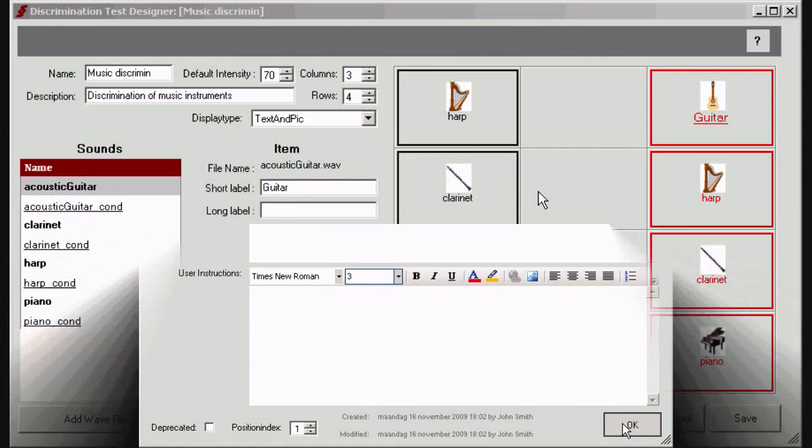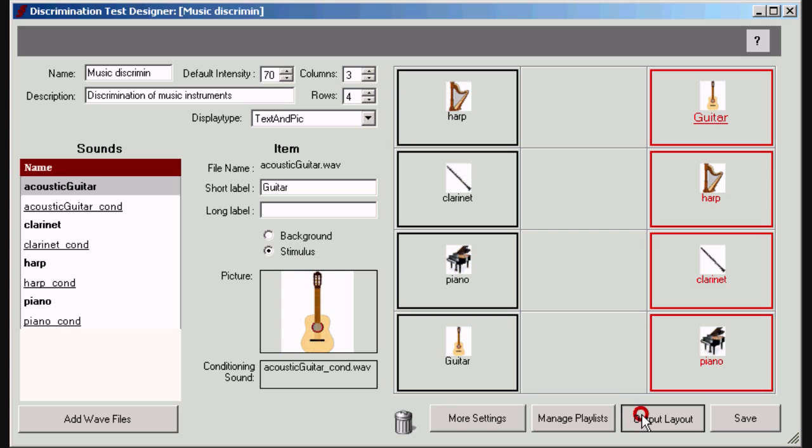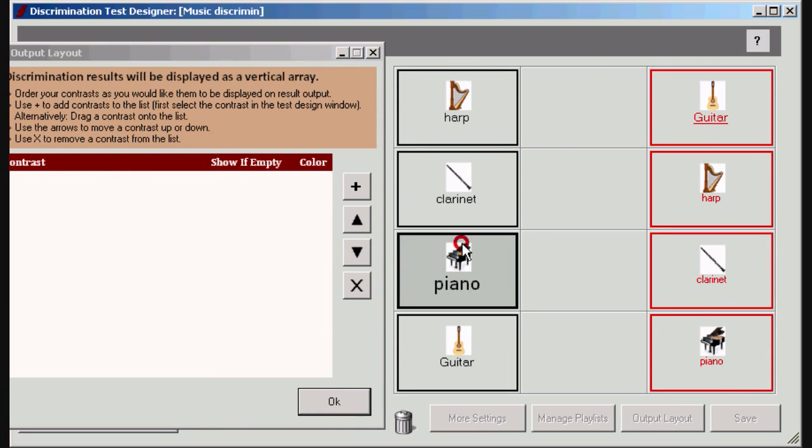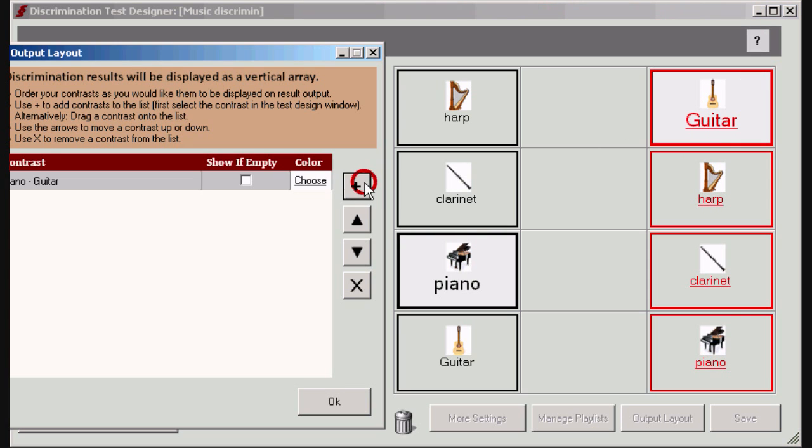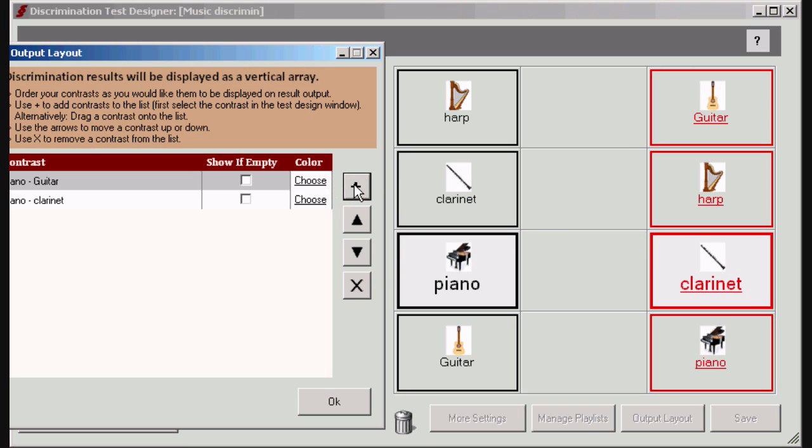You can also manage the way you want to display the test results on the results sheet. By default, only results will be shown of items which have been tested. The display order will be the chronological test order. This default behavior however can be changed. You can impose a predefined display ranking by selecting a contrast and adding it to the display list.